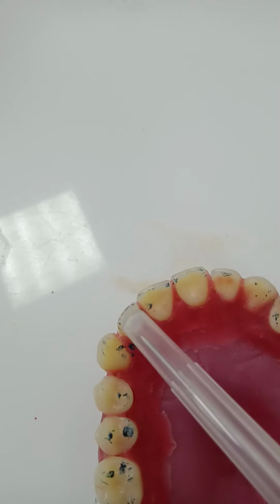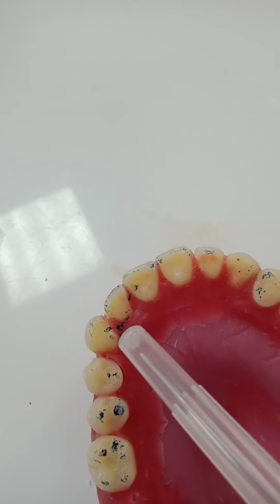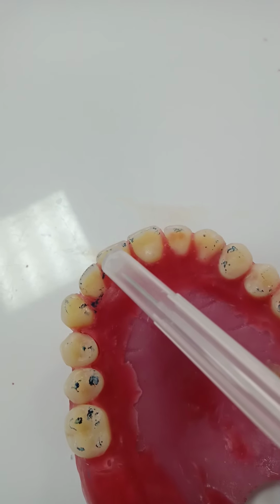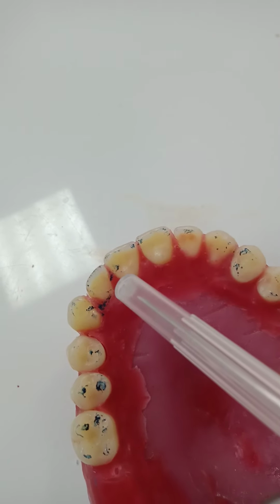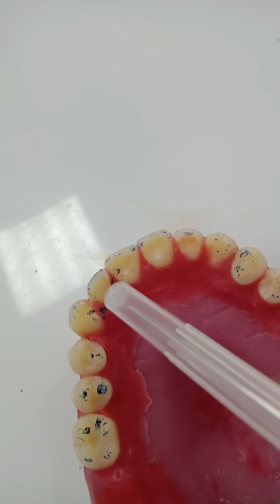We had another problem. When you remove the denture from inside the patient's mouth, this lateral was out of wax, had gone buccally or labially. The reason for this, it was involved in a heavy incisal guidance, okay? But what could we do? We have the lower teeth irregular in form, and some of them have overerupted because of the periodontal disease.